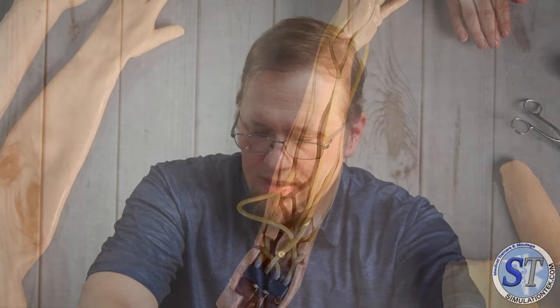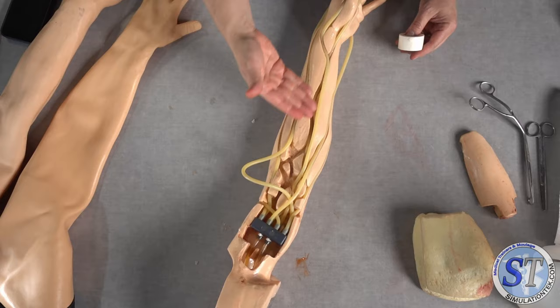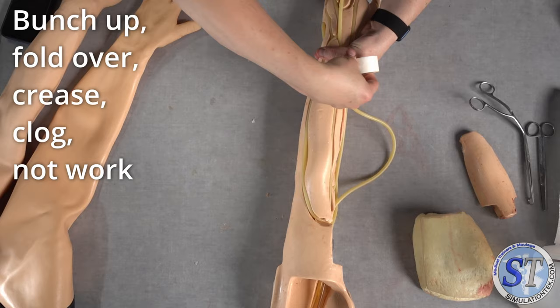Some of these don't follow through and they don't hold in, well, that's where the tape comes into play. So this is a silicone core, so the tape's not going to actually stick to it. So you got to band it around, get it on itself. What we want to do is make sure these are sitting in the channels. We don't want them sticking out, because if they stick out like that, what's going to happen is when you put the skin on, it's going to bunch up, and that will cause you all kinds of problems.